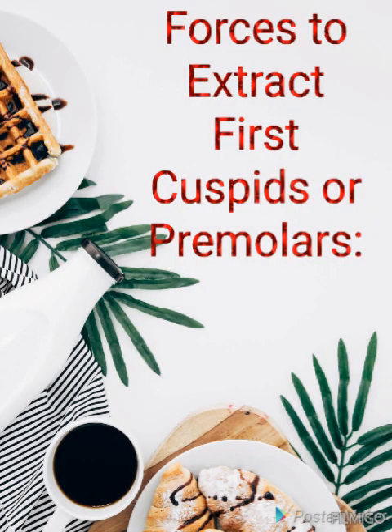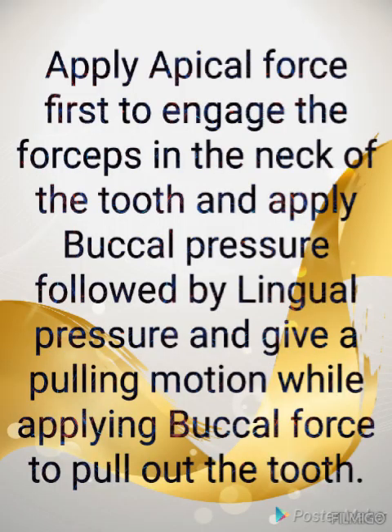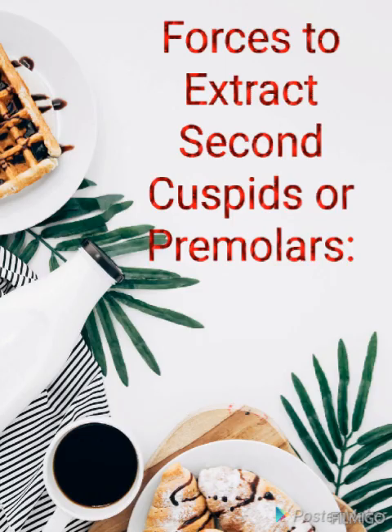Next we are going to see forces to extract maxillary first premolars. How will you extract the first premolar? Apply apical force first to engage the forceps in the neck of the tooth, apply buccal pressure followed by lingual pressure, and give a pulling motion, while applying buccal force to pull out the tooth. Here there is no rotation. We have to note that point. So give apical force and buccal force, followed by lingual pressure and a pulling motion with buccal motion.